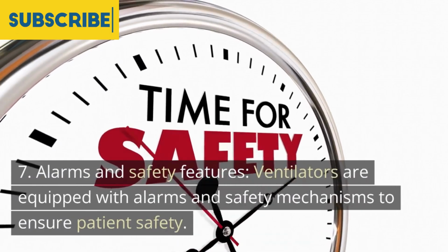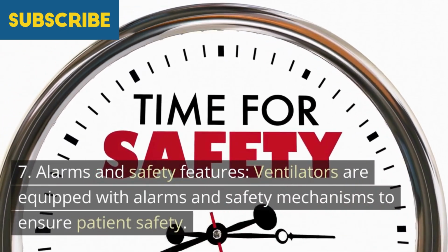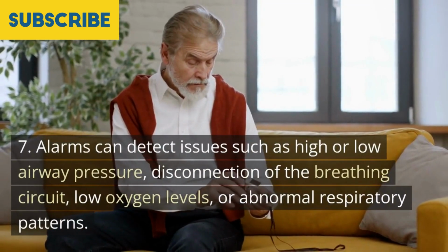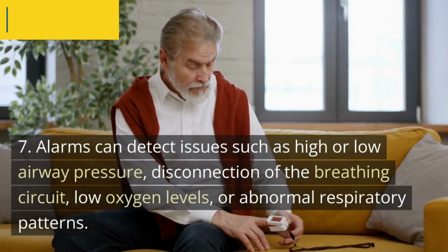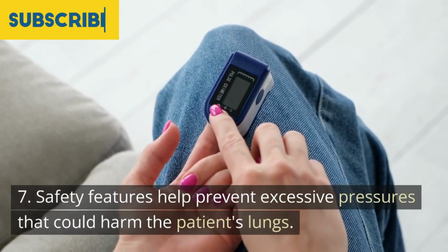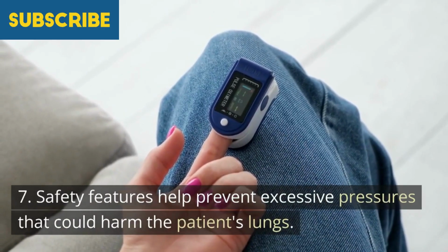7. Alarms and safety features. Ventilators are equipped with alarms and safety mechanisms to ensure patient safety. Alarms can detect issues such as high or low airway pressure, disconnection of the breathing circuit, low oxygen levels, or abnormal respiratory patterns. Safety features help prevent excessive pressures that could harm the patient's lungs.